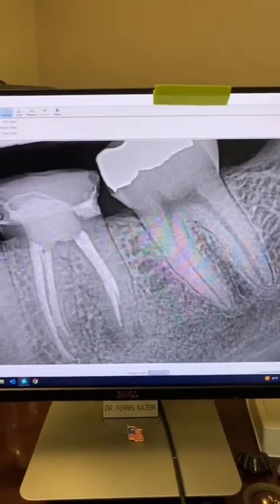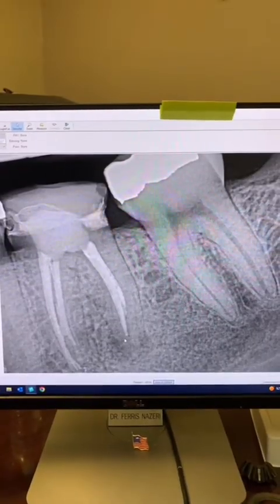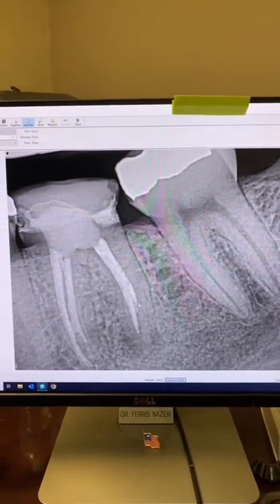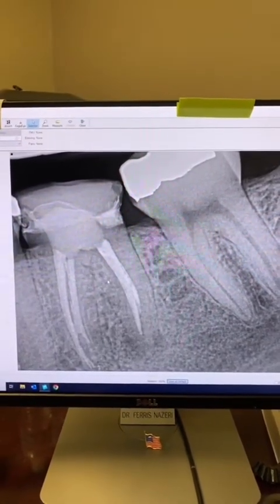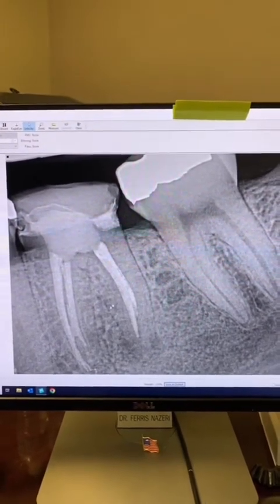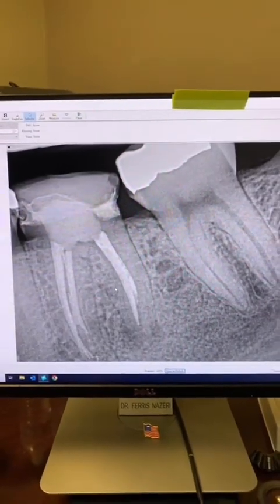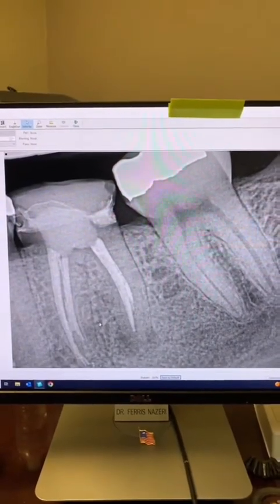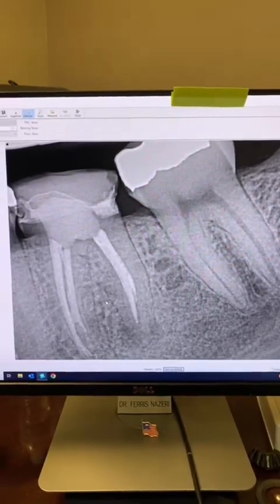All right. When you look at this radiograph, then you can see why there's a problem here. Of course, the dentist left necrotic tissue and bacteria behind, but also missed the canal. Distal has another canal. So I don't need to take a CBCT because with just 3 PAs, I figured out what's wrong with this tooth and what my course of action is. So no need for a CBCT, in my opinion, because 1, 2, 3 PAs, and I can already know what the problems are.